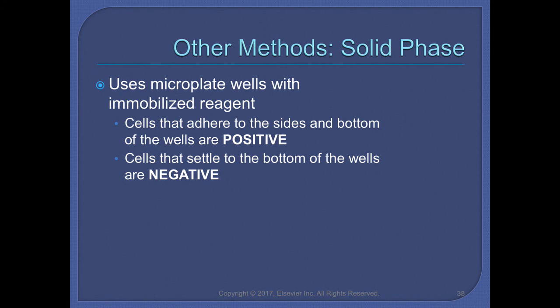For indirect testing, the red cell membranes are bound to the wells. An unknown patient or donor serum is added to react. This step allows for the capture of the IgG antibodies from the patient or donor serum to the red cell membranes.